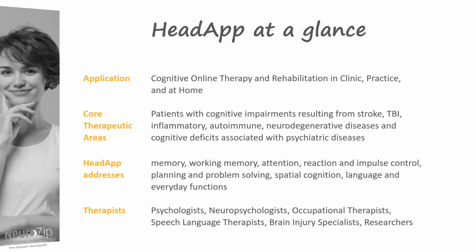If you are looking for the most effective care for your clients, we are convinced you will like the evidence-based, clinically proven and very simple to use HeadApp system. HeadApp is the professional's choice for computer-aided cognitive rehabilitation and offers class-leading performance for clinics, practices, rehabilitation centers, mobile use and in-home rehabilitation via internet.